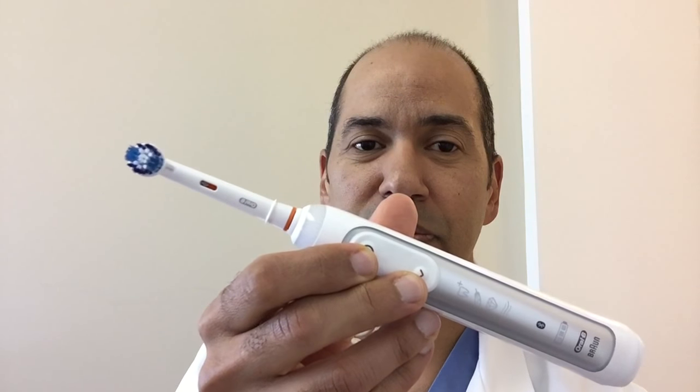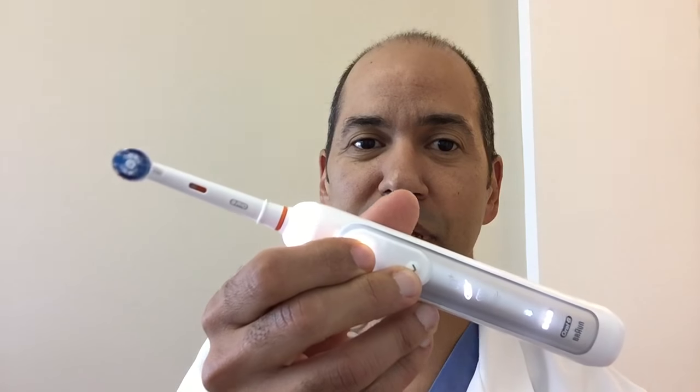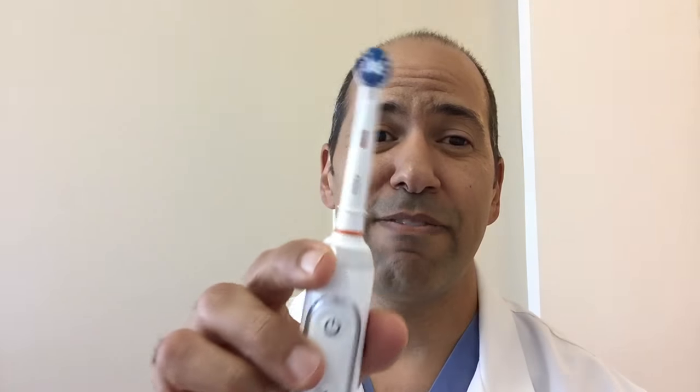Back to how to clean full arch implants: a toothbrush is still number one. This is my favorite — the Oral-B toothbrush, which I use myself. Brush for three to five minutes with this tiny soft little head; that's what's going to do most of the work. Make sure you brush all the way down at the gum line, under the pink part, right at the junction where the gum meets the tooth.